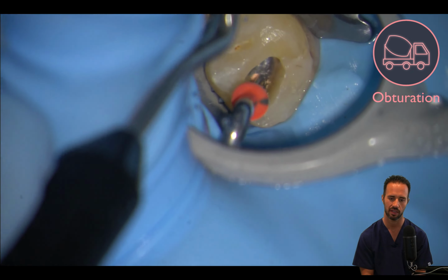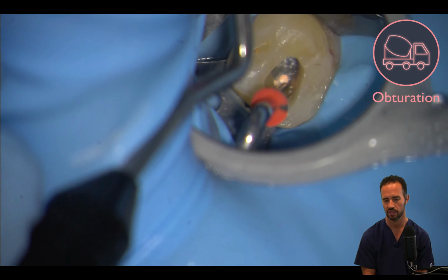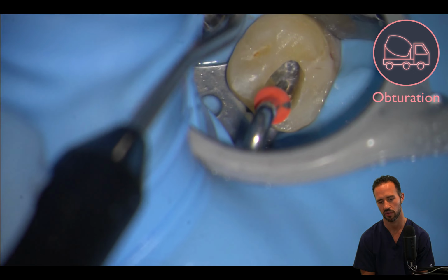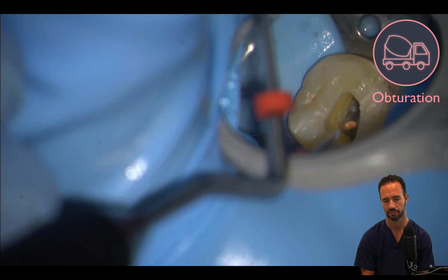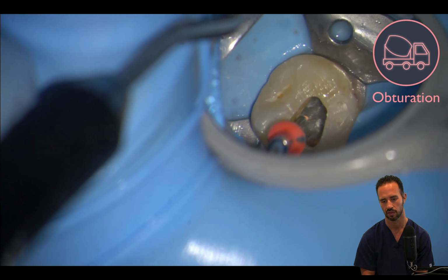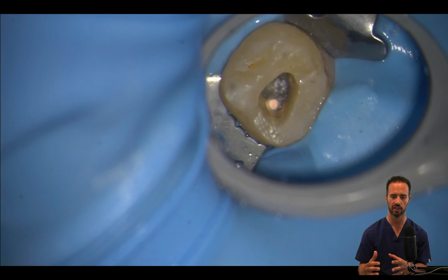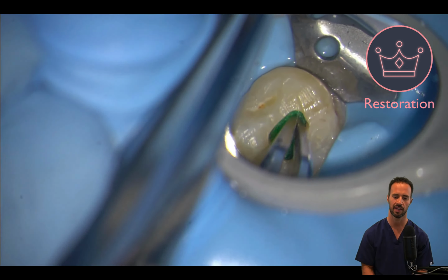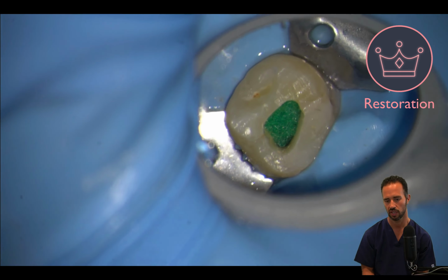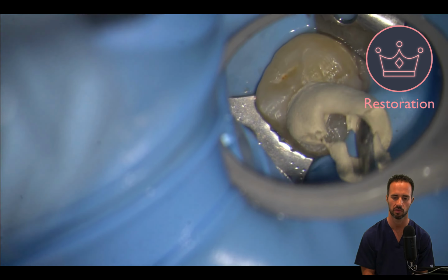Good. You want to have a nice, neat area to work with. And you can tell the stage has been set now for your core buildup, which is only going to take you an extra few minutes, right? And notice the access preparation is just large enough to have straight line access into the 3 canals, but is not crossing the oblique ridge and is not going too deep into the area of the mesial marginal ridge.